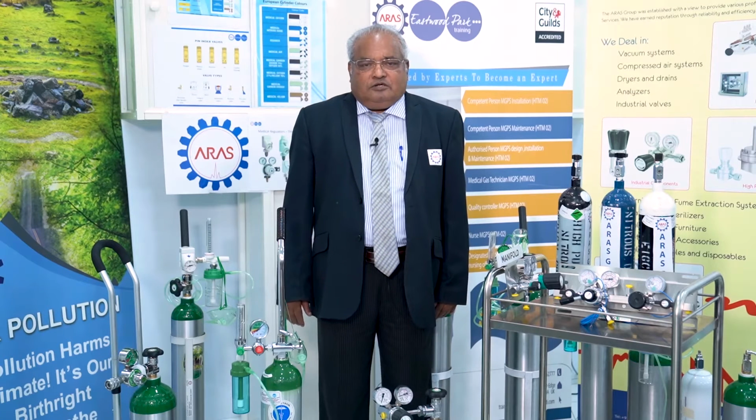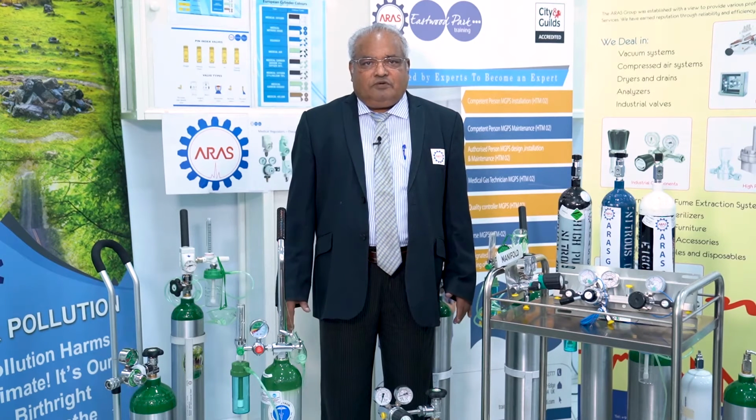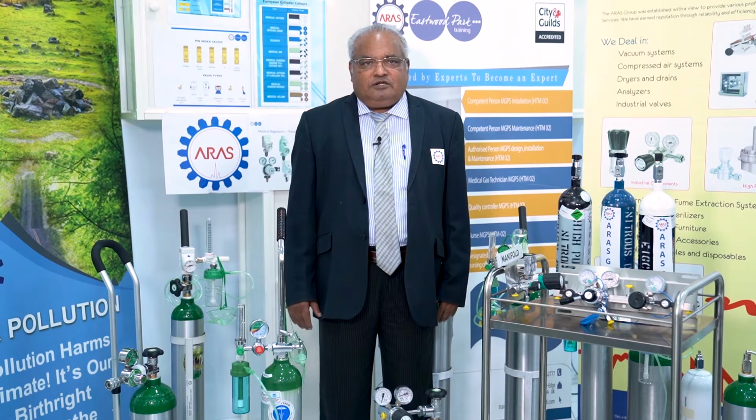We are talking about the different types of cylinders, regulators, and connections. The reason is that the coronavirus is now affecting the whole world, and certain countries are getting donations from other countries. But different countries use different standards for oxygen cylinders, so you get different colors of cylinders and different connections, and certain standards do not match each other. That's why I'm trying to explain the big difference in each and every connection.